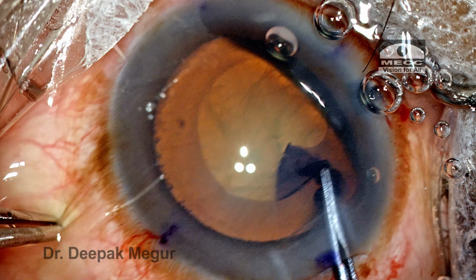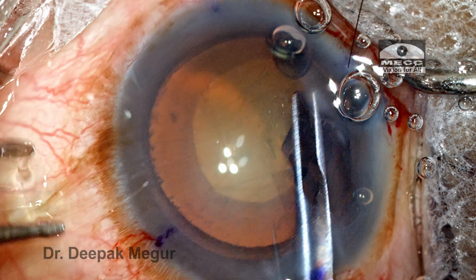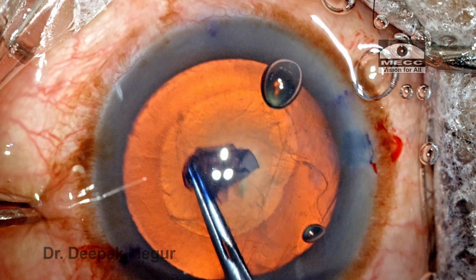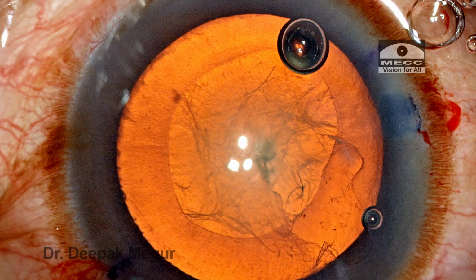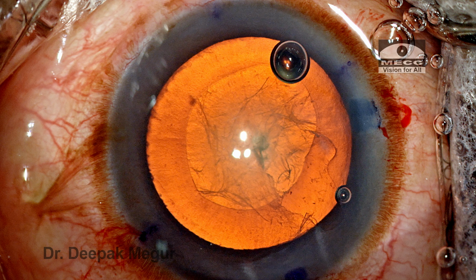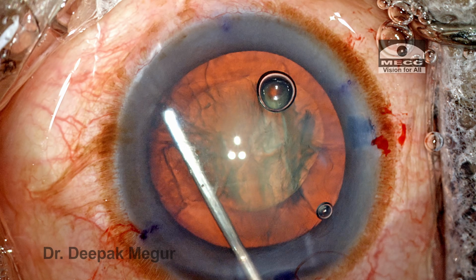I am considering using the IOL trap technique with the hydrophobic multipiece lens, the haptics being in the sulcus and the optic in the bag. So for that, sizing of the rhexis becomes extremely critical. Thankfully, the rhexis went according to plan. I have a well-centered, appropriately sized rhexis.